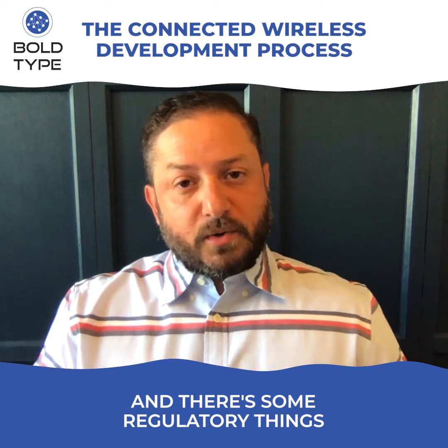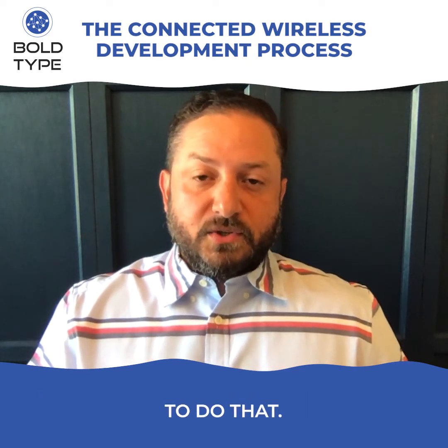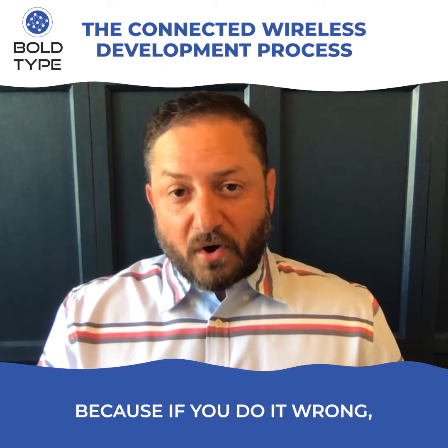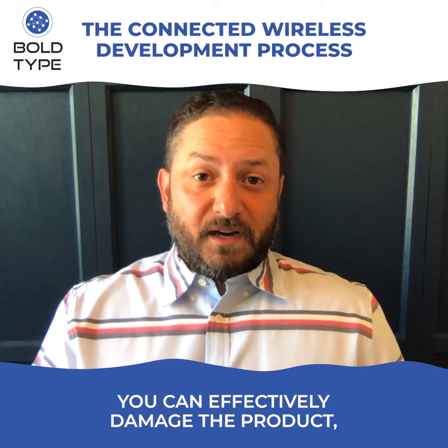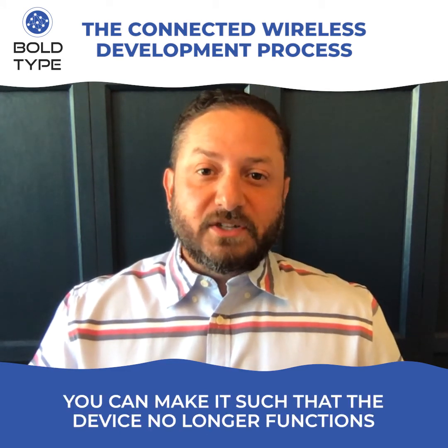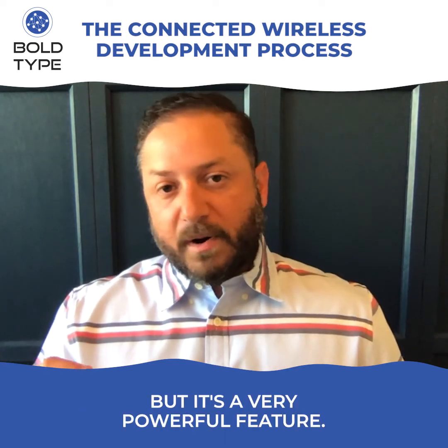And there's some regulatory things that you have to keep in mind, but you don't have to necessarily go through a new 510(k) to do that. So it's one of those strong benefits, but you have to make sure you do it right, because if you do it wrong, you can effectively damage the product. You can brick it. You can make it such that the device no longer functions and you can't update it. So it's really important to get that right, but it's a very powerful feature.